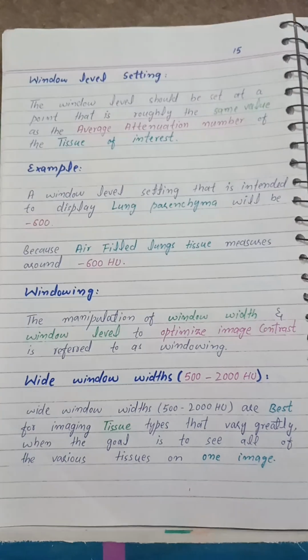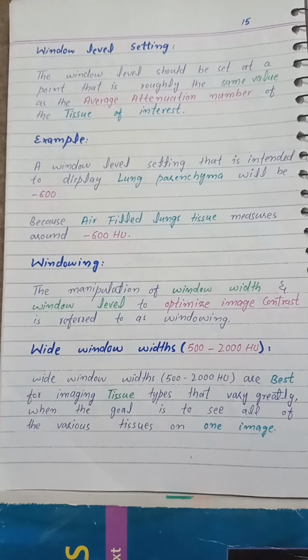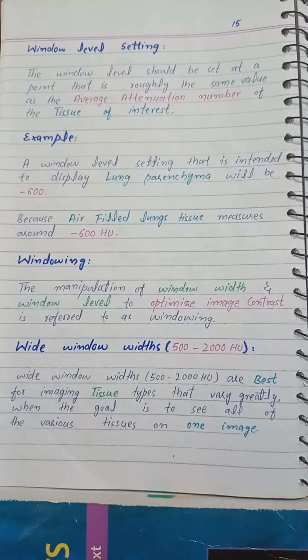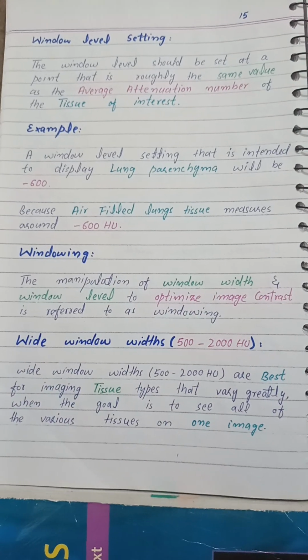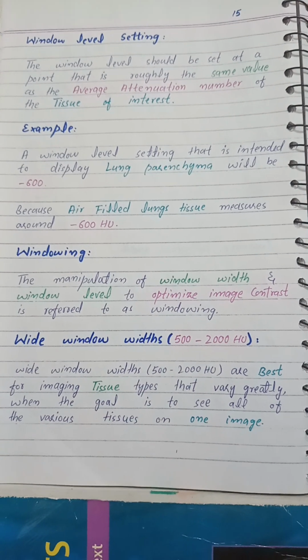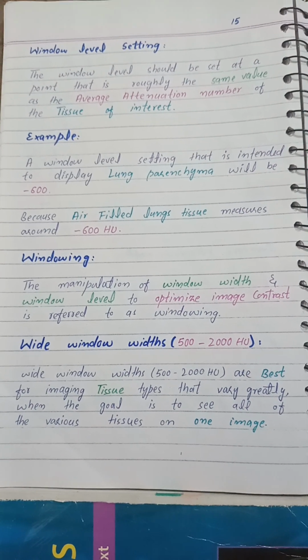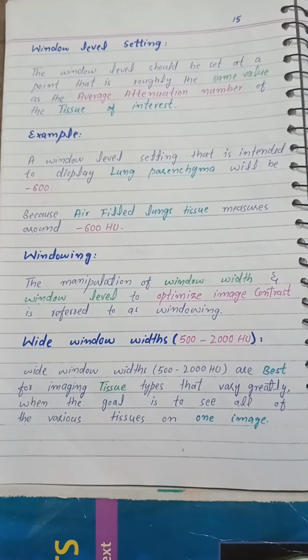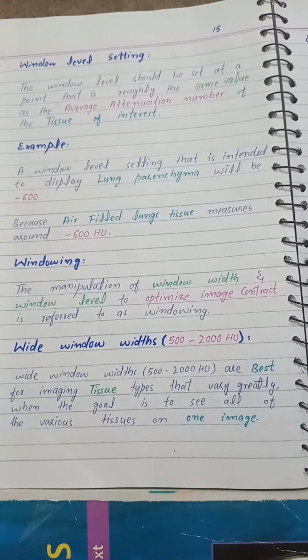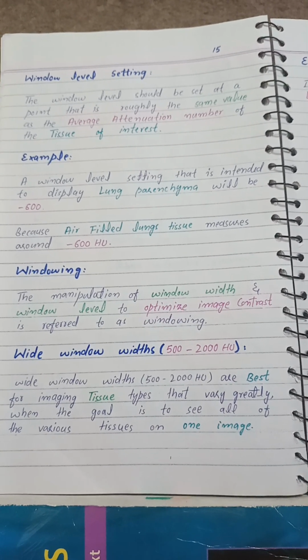Window level setting. The window level should be set at a point that is roughly the same value as the average attenuation number of the tissue of interest. For example, a window level setting intended to display lung parenchyma will be -600, because air-filled lung tissues measure around -600 Hounsfield units. Windowing: the manipulation of window width and window level to optimize image contrast is referred to as windowing.